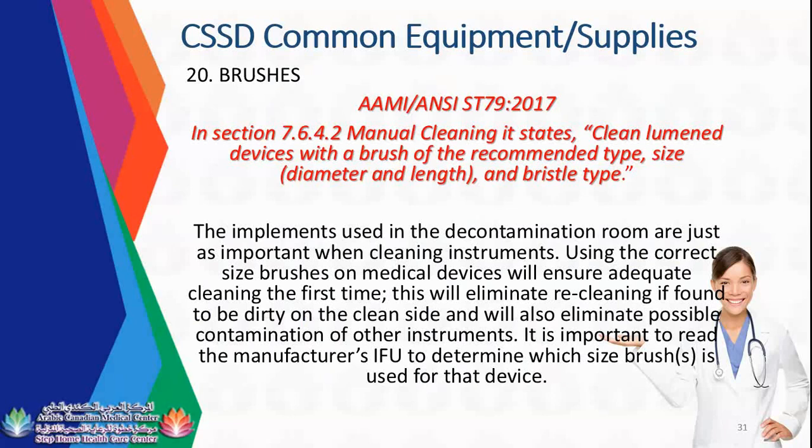So to avoid re-cleaning the instruments, you need to brush it thoroughly. Not that hard, just soft brushing. Unless the blood was dried in the instrument, it is difficult to remove. You need to manually remove it. Sometimes you need some pointed instruments to remove the blood if it's dried in the instruments.